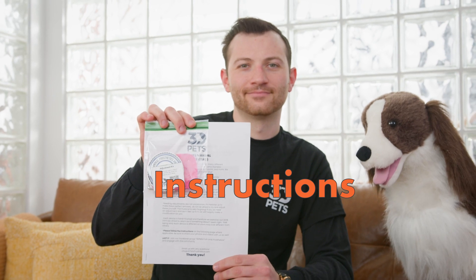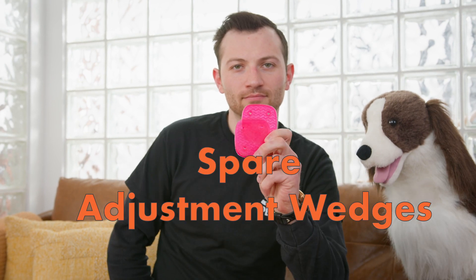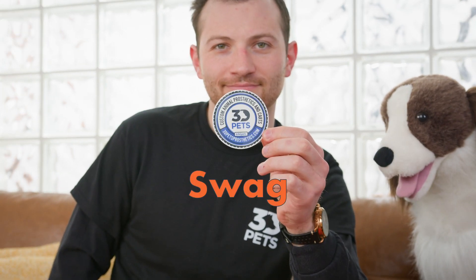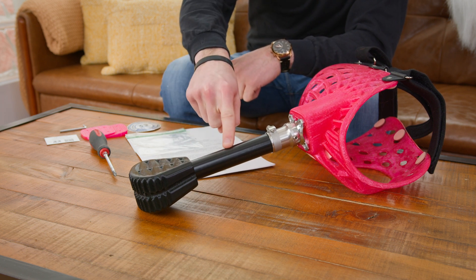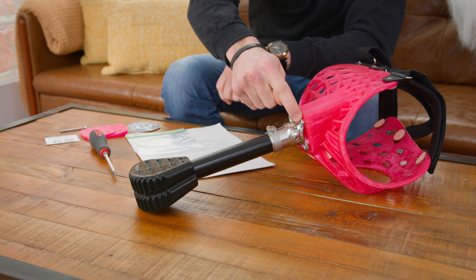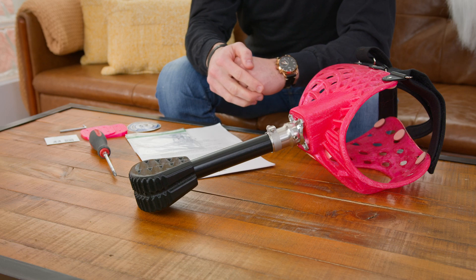Every device includes a packet. It includes our instruction sheet, our adjustment kit guide, our spare wedges, our allen key, and a little 3D Pets swag. This is our shock absorbing foot, our pylon or leg, our pylon adapter, our pyramid mount, and our harness. This is so you know what we're talking about when we're adjusting.